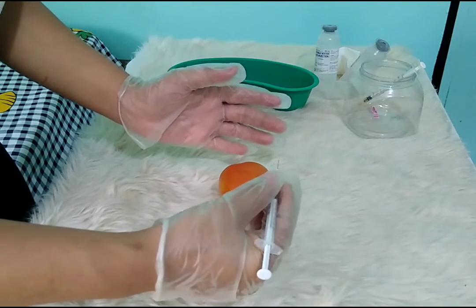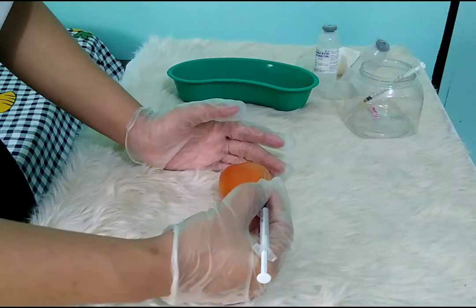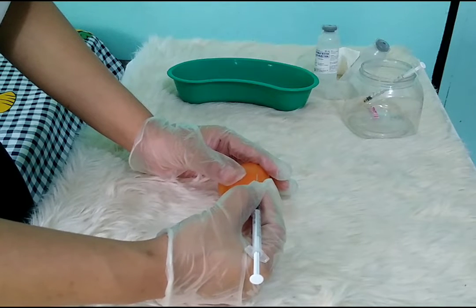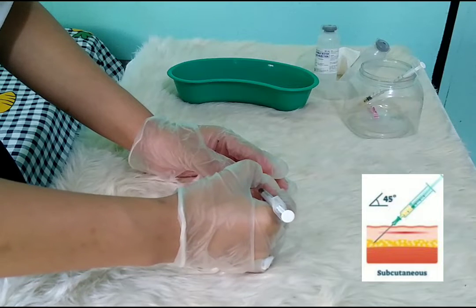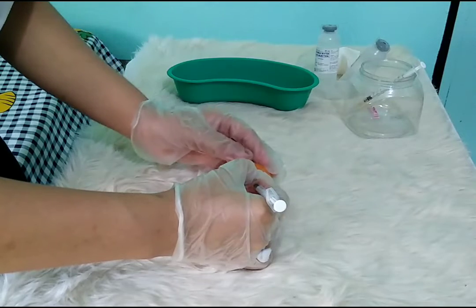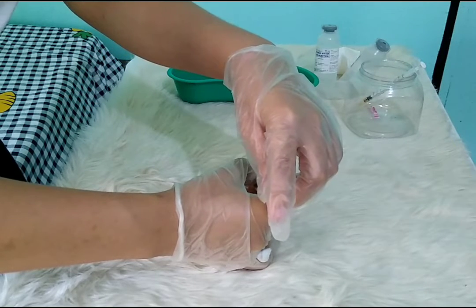Grasp the syringe with the dominant hand and hold it between the thumb and the finger. Use the non-dominant hand to pinch and spread the skin at the site and insert the needle. After the needle is inserted, move the non-dominant hand to the end of the plunger.